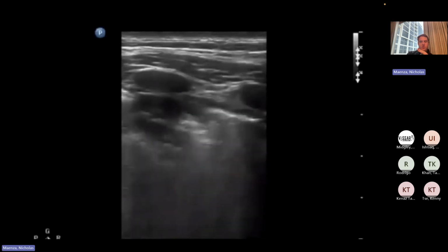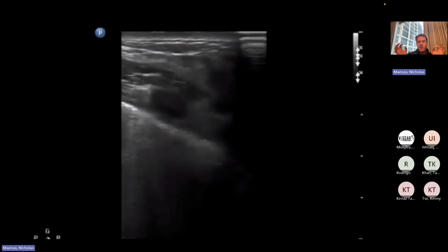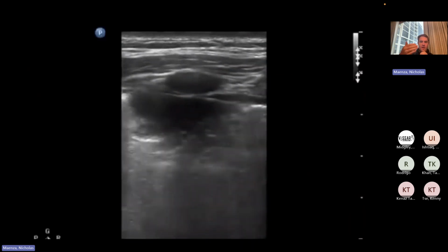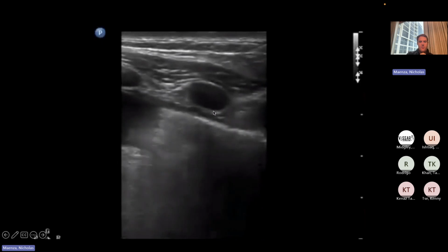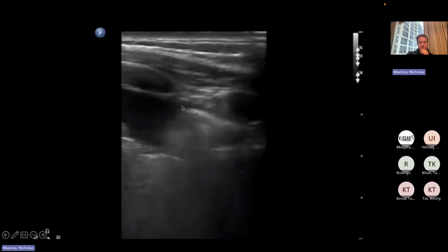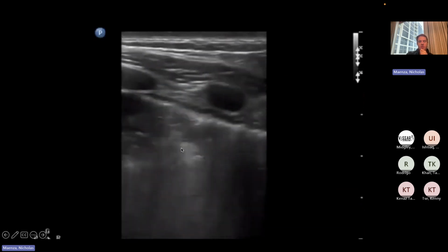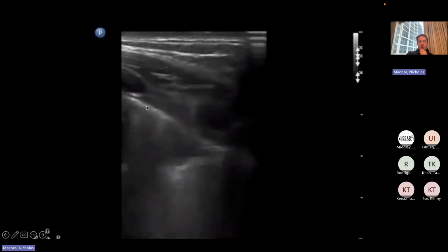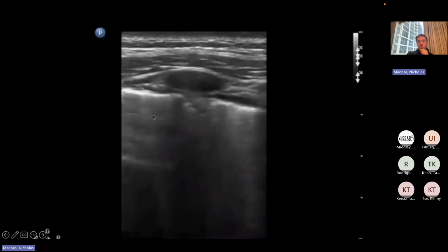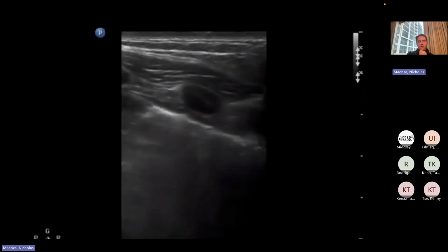All right, so those are all consolidations. At this point, we're getting into subpleural consolidations, AKA tiny little areas of infection just underneath the pleura. So this image is, again, just rib, and the patient, they're sliding their probe up and down. And what we're looking at is that visceral and parietal pleura sliding back and forth. And in certain areas, you see this big, the technical term is a big little goober stuck there that's just sliding back and forth. So this is subpleural consolidation. This is another sign for a pneumonia.